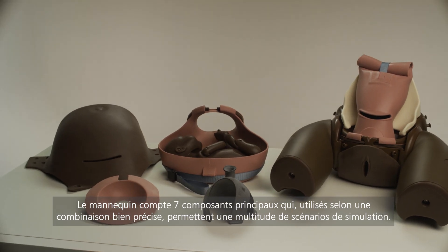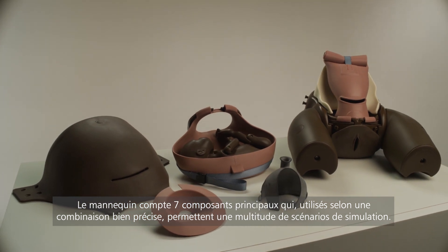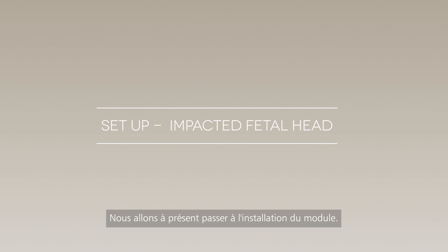The trainer is made up of seven main components which, when using the correct combination, allow for a range of simulation scenarios. We'll now take you through the setup process for impacted fetal head training.